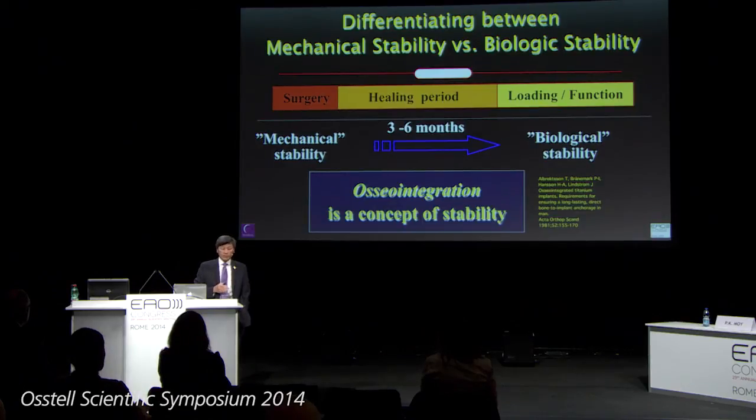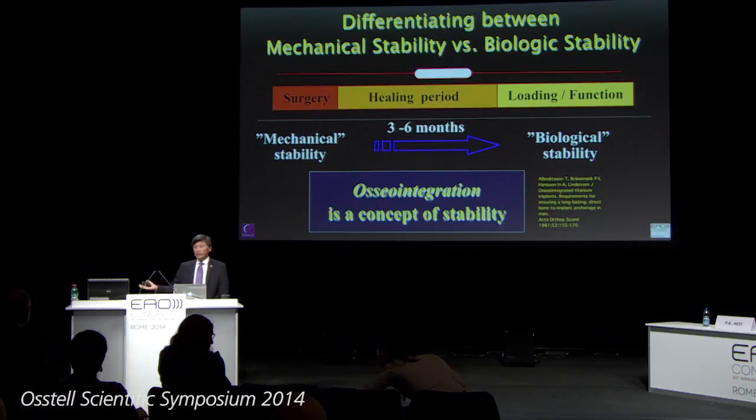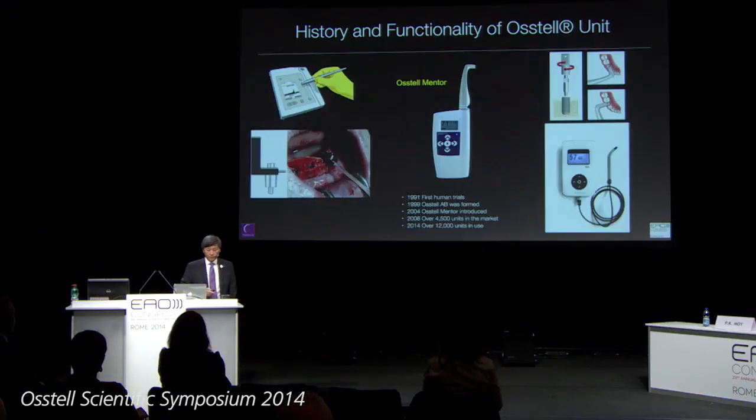We know that because of the experience that we have in healing fractures. Unfortunately, not every patient has started to convert at 3 weeks. And not every patient has completed that conversion from mechanical to biologic stability at 6 weeks. Some take 8, some take 12, some take 24 weeks. And so this is what we're trying to find out. And it all starts with primary stability.